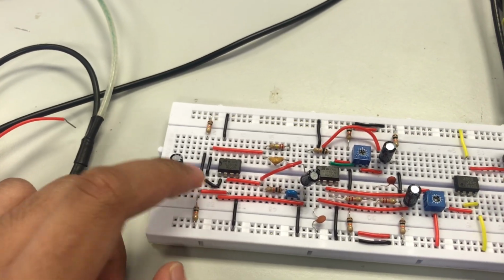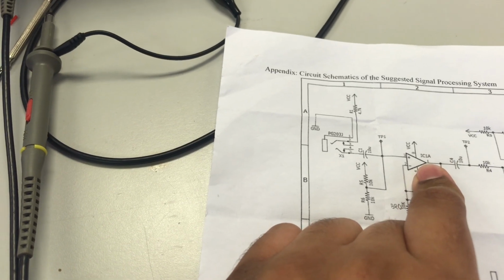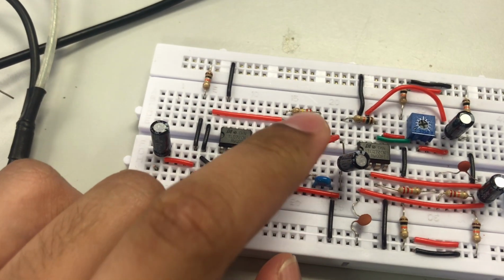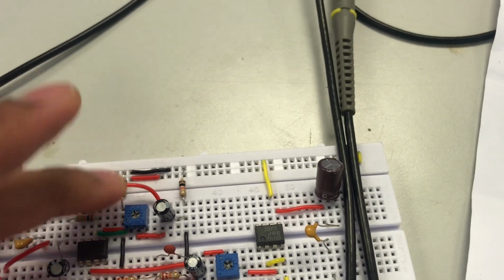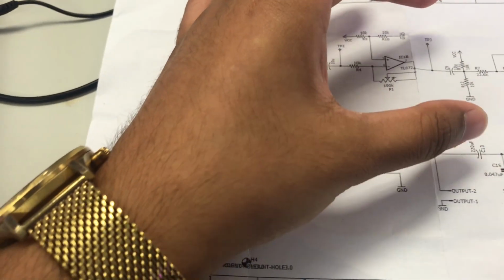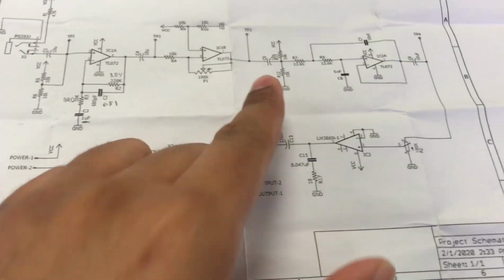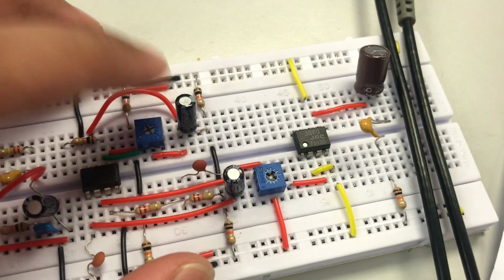My second test point, however, will be at TP2, which is set for using the first pin between C4 and R4. So that will be basically somewhere around this place. Yep, because this is the exact line we have here. So that'll be TP2, and TP3 is behind a capacitor, so it should be here.